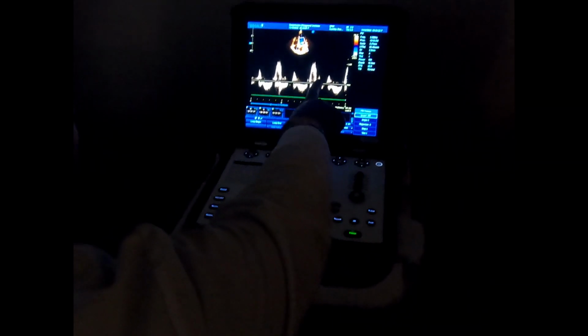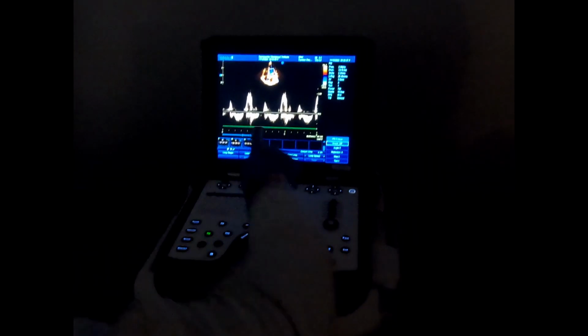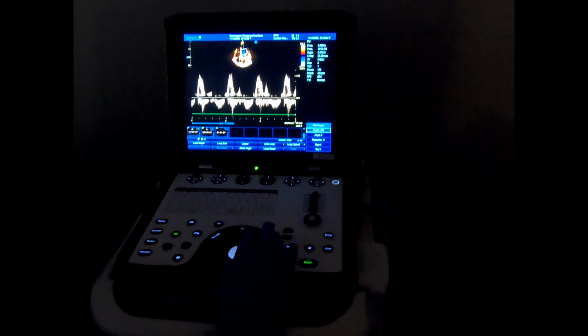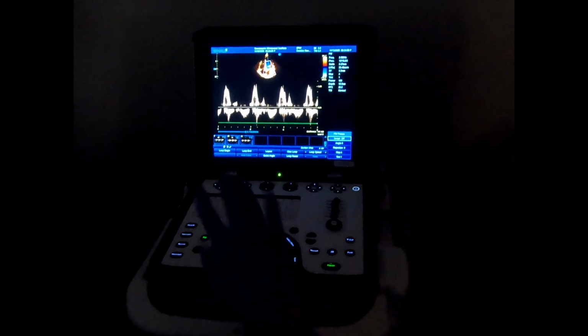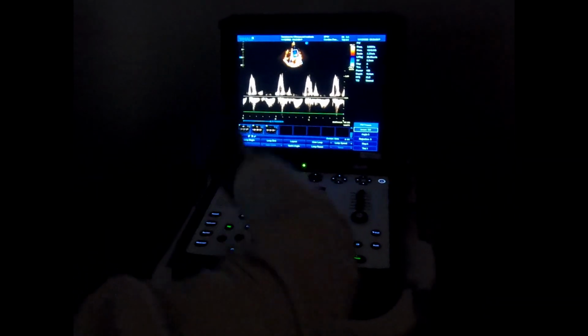See that these are fuzzy and very immediate. This is the A. If this is happening, it's a little Doppler artifact, you just ignore those. These are not the peak, but the first one is the peak.